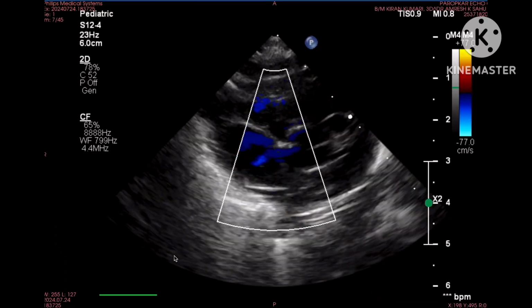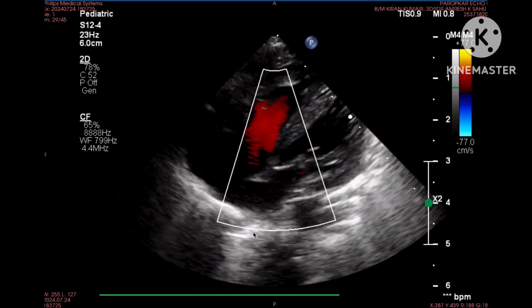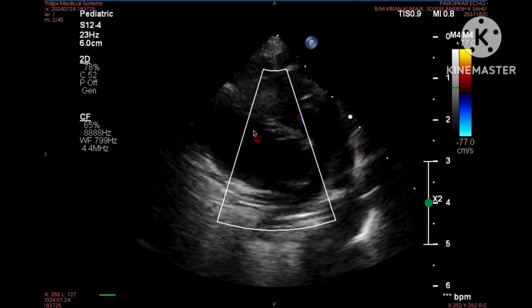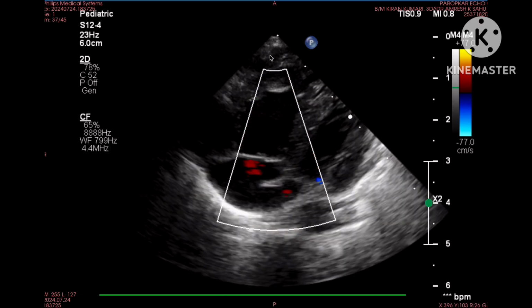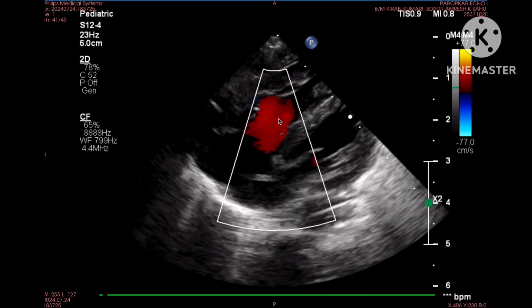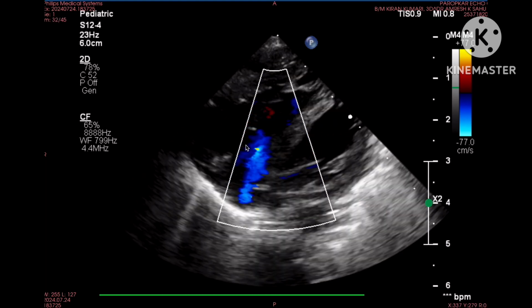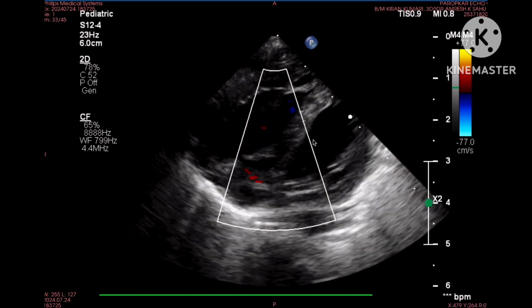Persistent pulmonary hypertension of newborn along with ASD, VSD and PDA. In this 4-chamber view, you can see the right atrium and right ventricle dilated compared to the left atrium and left ventricle. Though the view is mainly right ventricle oriented, you will normally get a bigger right ventricle and right atrium, even if it is relatively small. In spite of all that, this case has a large right atrium and right ventricle compared to the left atrium and left ventricle.